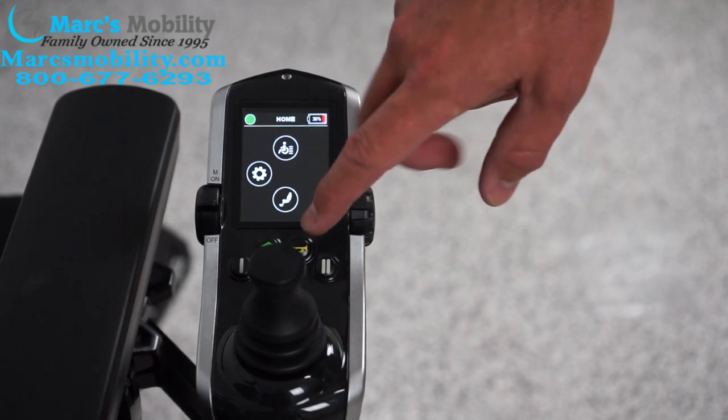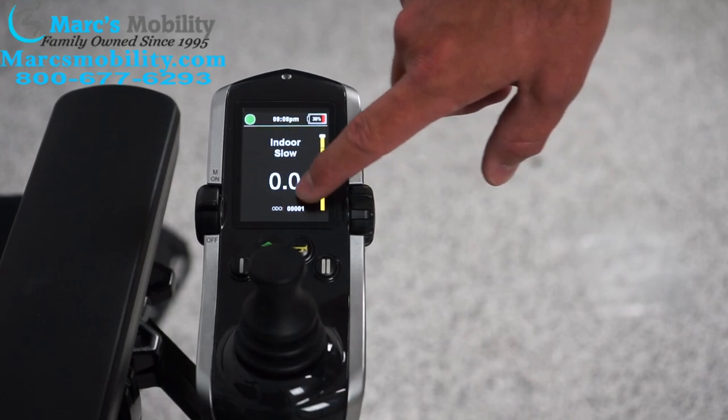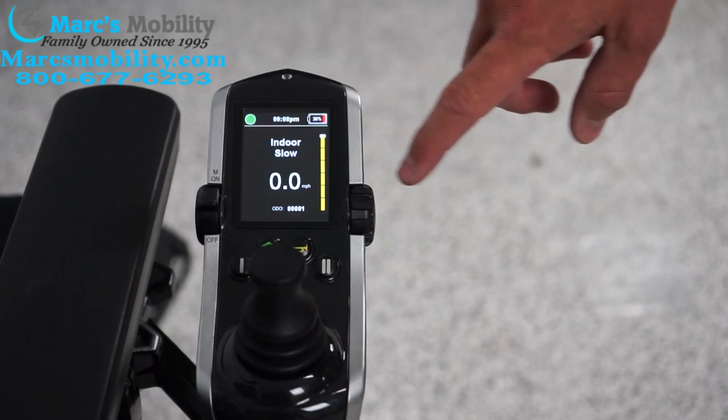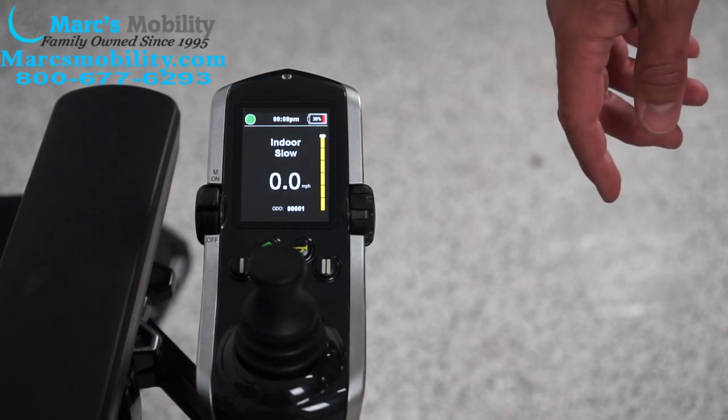Sometimes people look at the screen and want to know what the distance reading is. It can be set to the odometer like in your vehicle, but you can also have it set to a trip distance if you're trying to monitor how far you've gone on a single charge.